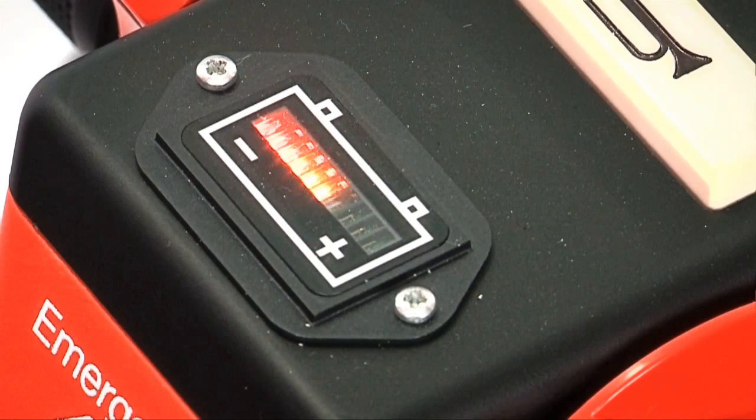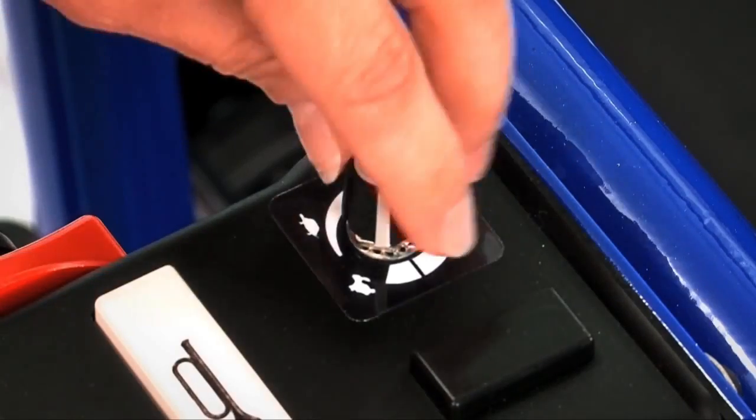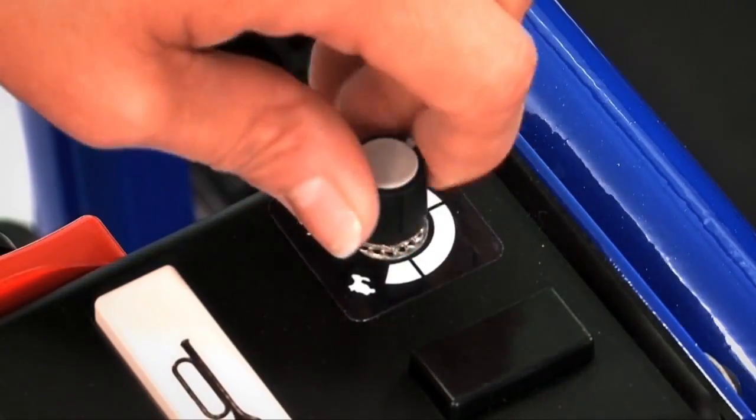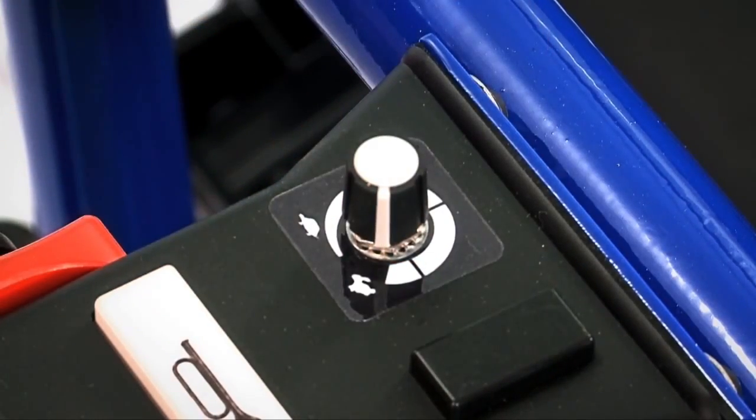and three green LED lights to indicate the current level of charge. As power is used, the green, then yellow, then finally the red will turn off. To control the top speed of the Breeze, turn the dial left to the turtle position for lower speed or right to the rabbit for higher speed.